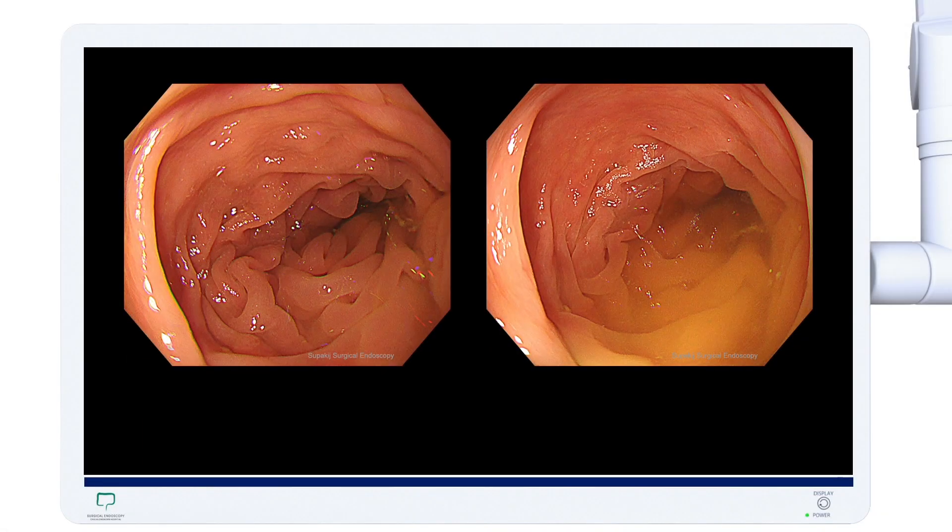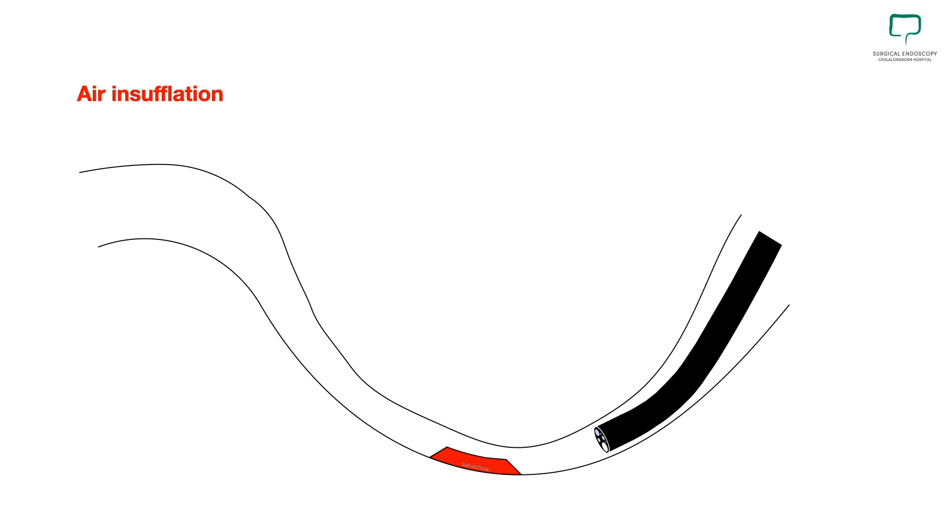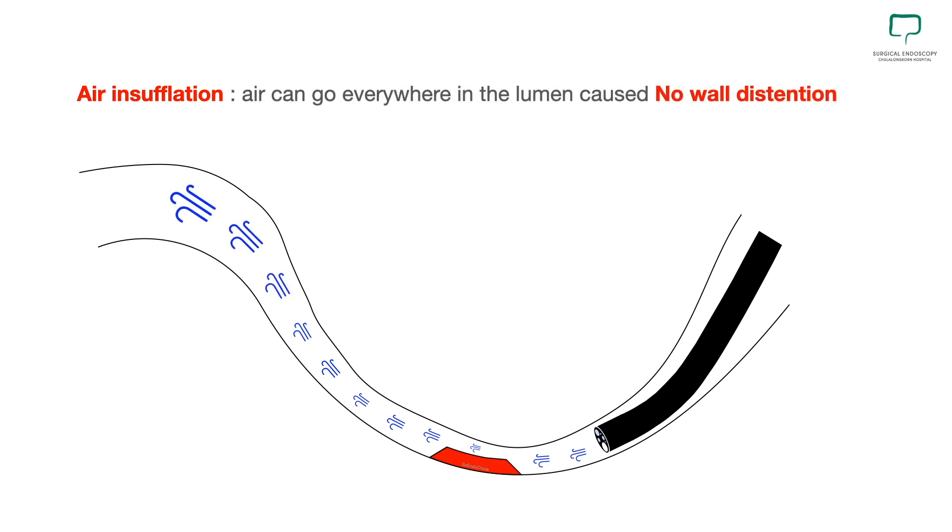Have you ever experienced this situation? Bowel contraction and fluid that remain in the colon, if combined together, is the nightmare for endoscopists. When we find a lesion and the colonic lumen is not fully distended, as endoscopists the first thing we do is insufflate air to distend the lumen. But sometimes we have the problem with bowel contraction, even with anti-spasmodic agents such as Buscopan already given to the patient — especially in parts like the sigmoid colon, which has a narrow lumen. With air insufflation, air can go everywhere in the lumen, so sometimes we cannot make wall distension and the problem still exists.